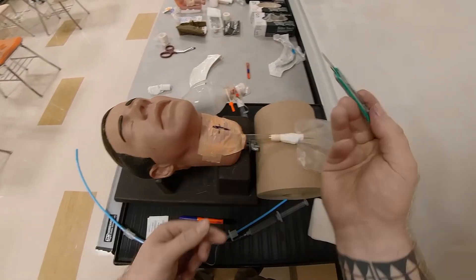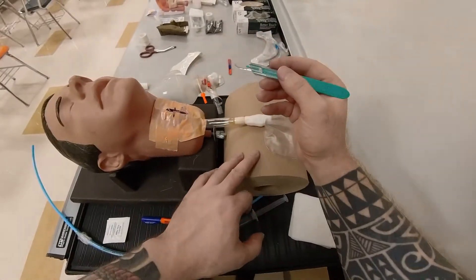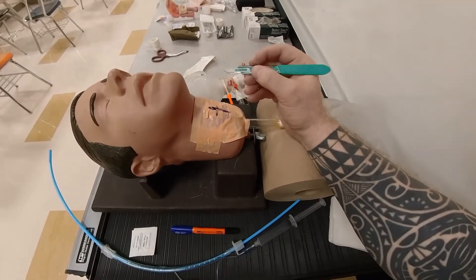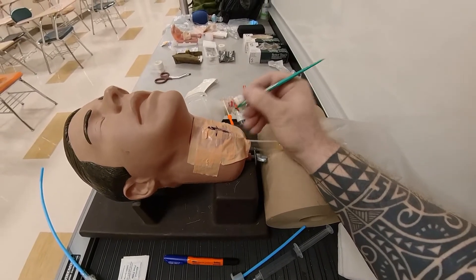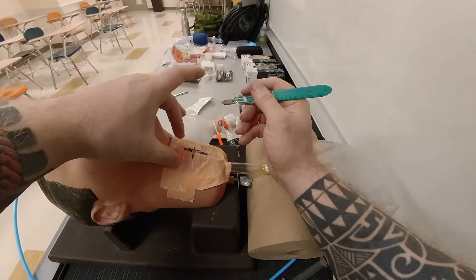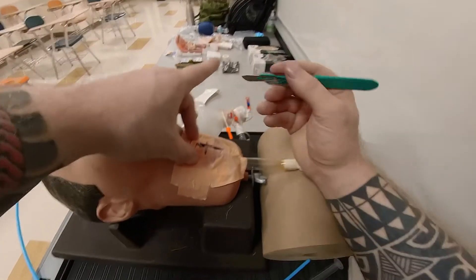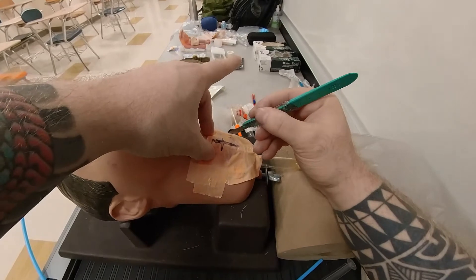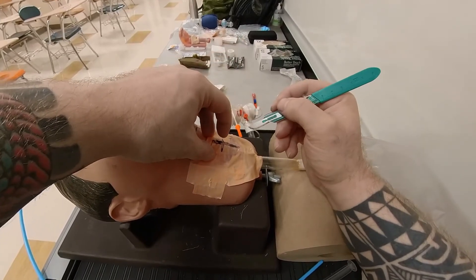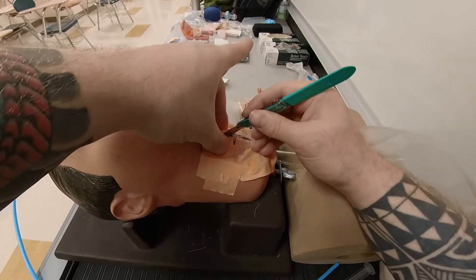Expose the scalpel. When performing this procedure, you want to rest your arm on the patient's chest. Hold the scalpel like a pen or pencil, as if you're writing. The non-dominant hand rests on the chin — thumb and middle finger stabilize the cricoid cartilage. You're not flailing about with the scalpel; you're resting on the patient's chest. When the scalpel goes in, this finger goes up. When the finger goes in to probe, the scalpel goes away. Get on location, fingers up, good stabilization, and make a vertical cut.